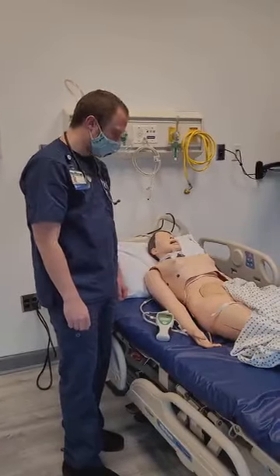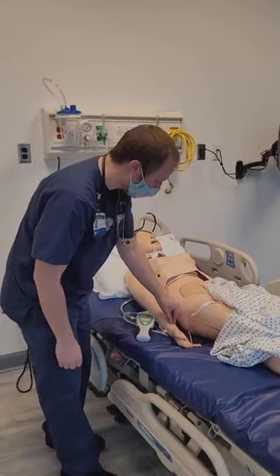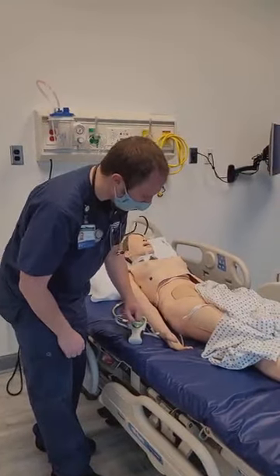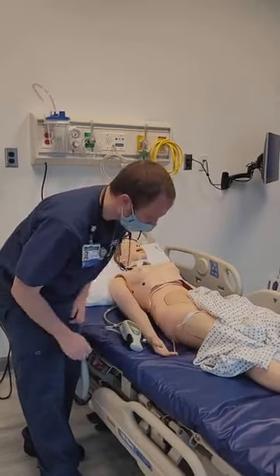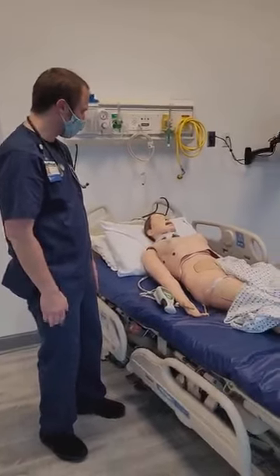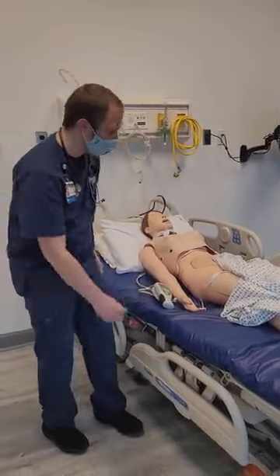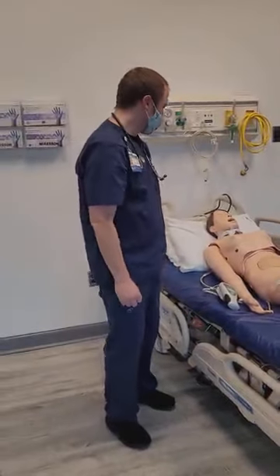And I'm going to check skin turgor now, less than 3 seconds. I would do that here actually, less than 3 seconds. I'm going to check O2 sat. I'm going to get their O2 sat, 99%.